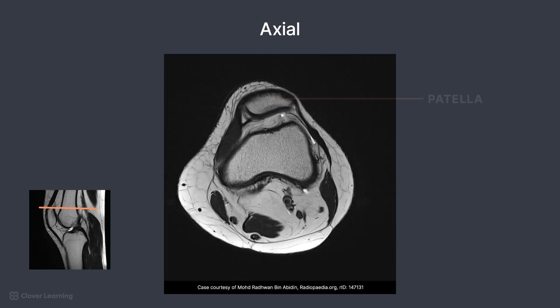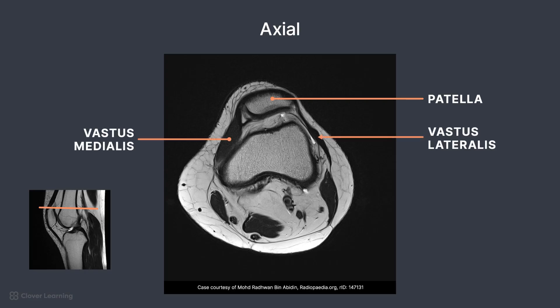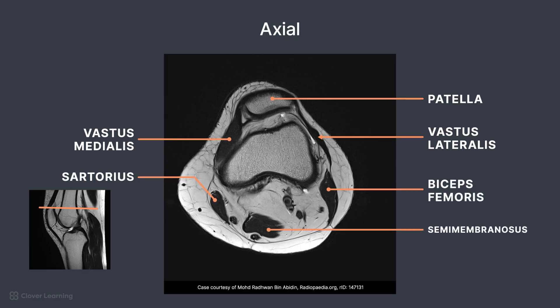Moving inferiorly, the patella is located anteriorly. Important muscles seen include the vastus lateralis, vastus medialis, sartorius, biceps femoris, and semimembranosus. Popliteal vessels are located posterior to the femur.